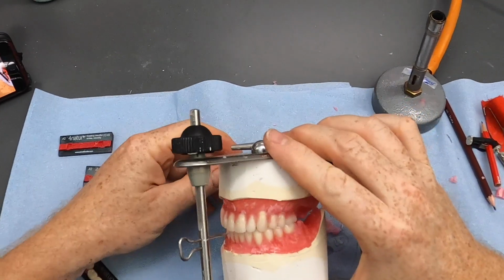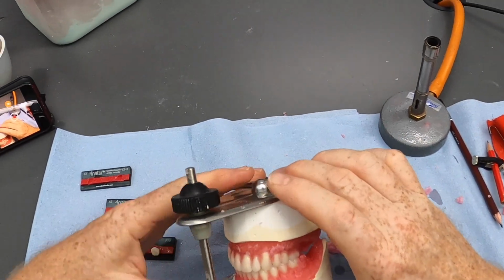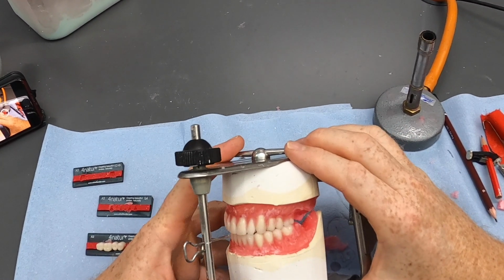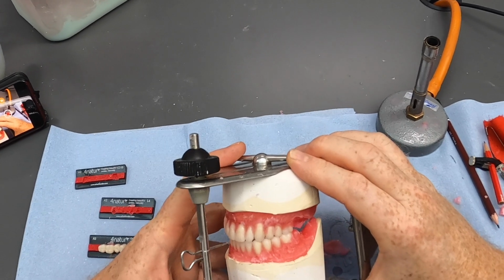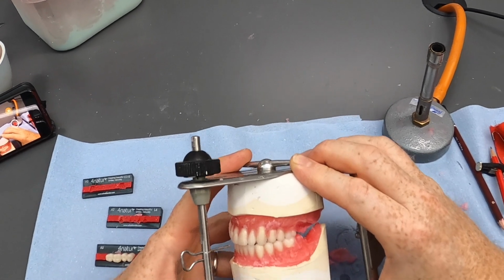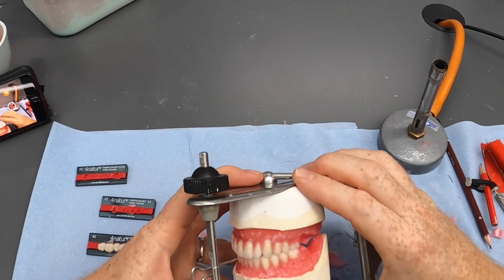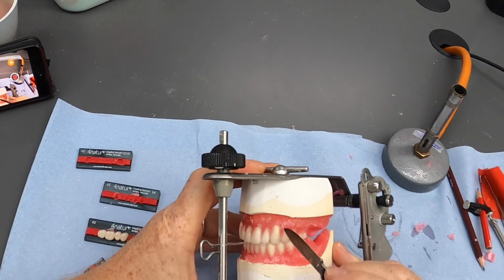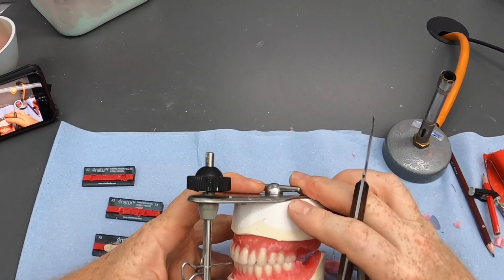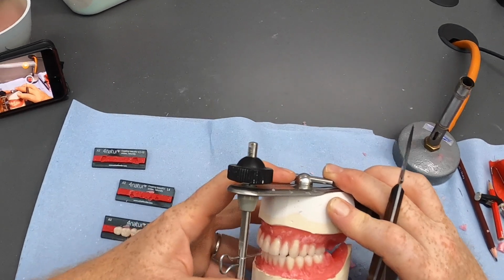The wax is still a little bit soft, so we might need to just let that cool down a touch before we tweak them into the final position and then do any grinding of the cusps to get the perfect contact. But you can see now when we go into that lateral excursion, we're not a million miles off there. So the 6 and the 5 look nice. There's a little bit gappy with that 4. Let's just see if we can improve that now, just by pushing that palatal cusp down a touch, and the buccal ones come down with it, and we're not far off at that, are we?